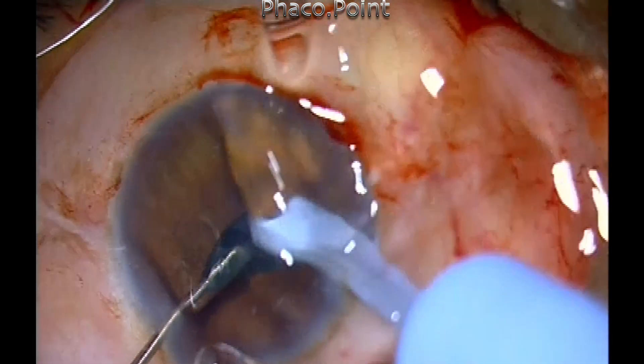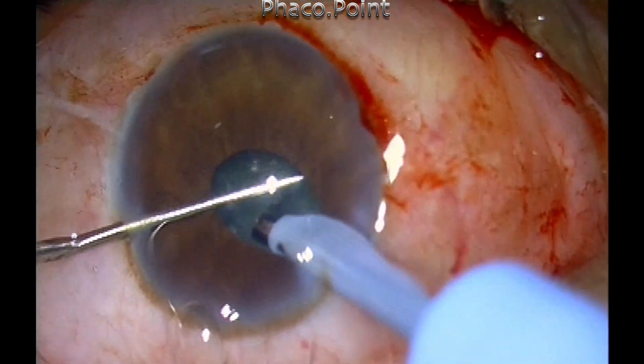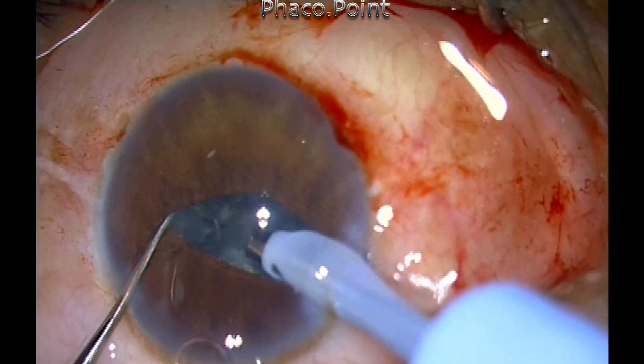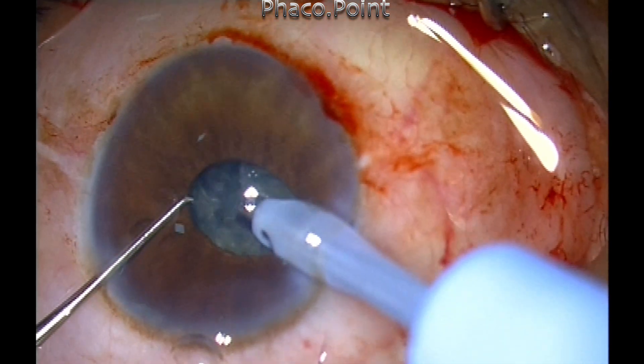When you have a good hold, you can use the sharp chopper to take it to the mid-periphery of the nucleus by retracting the iris gently and then creating the chop.